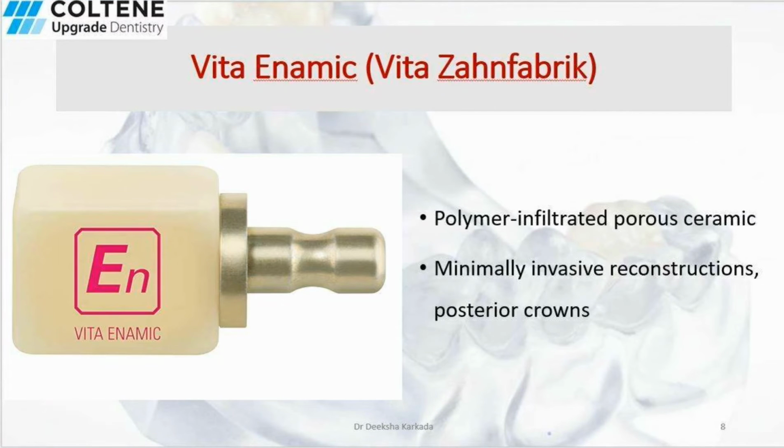Vita Enamic is a product which differs from both ceramic materials and composites. It has a polymer infiltrated porous ceramic and is used for minimally invasive reconstructions and posterior crowns.